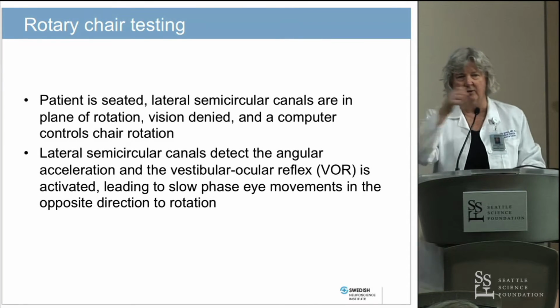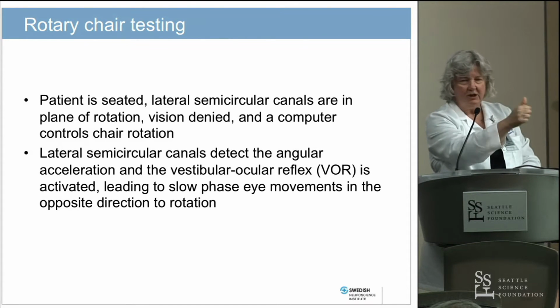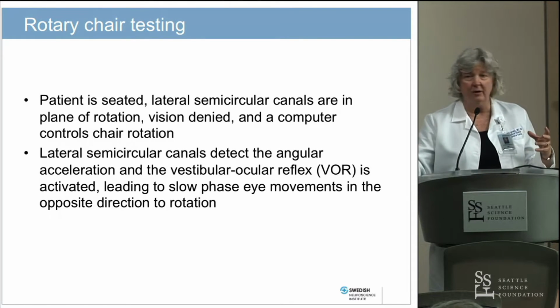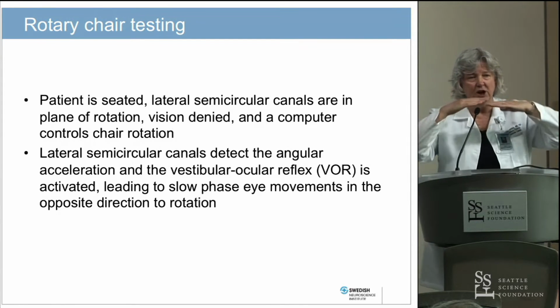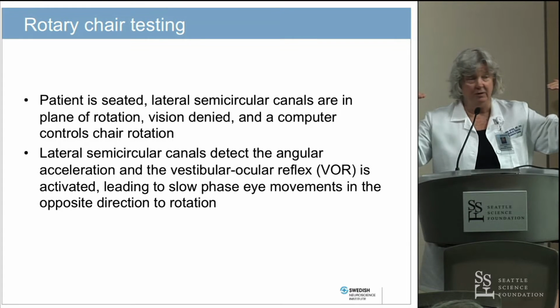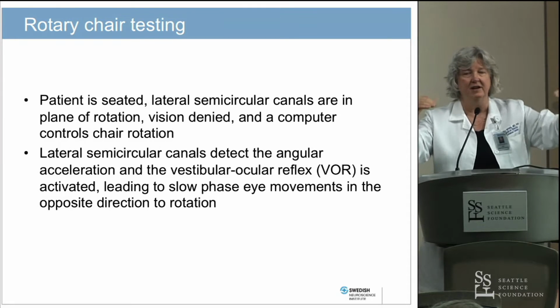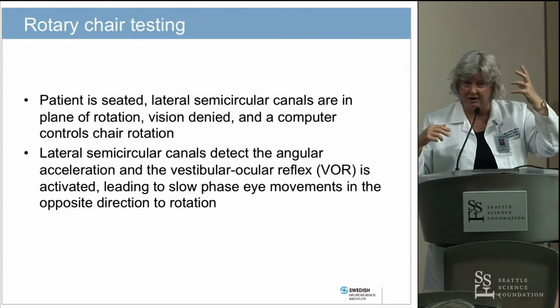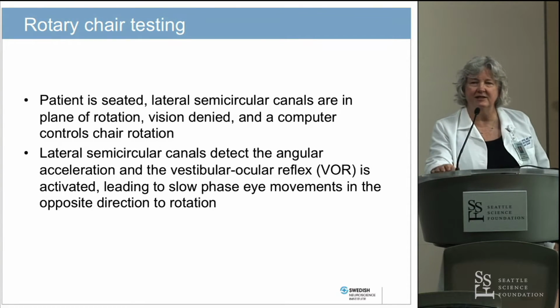Basically, what is vestibular ocular reflex? It's looking at a target, an object of regard, and being able to stabilize it while your head moves. In the acute period, postoperatively, they're not going to be able to do that. But after moving their head around for a month or so, most people, the good ear takes over, and we see a normal chair. So it's pretty good. There have been several papers published on parameters after vestibular nerve section and how the vestibular ocular system can run just with a good ear. But then this raises the question, how about those people who say, oh, I'm still dizzy?